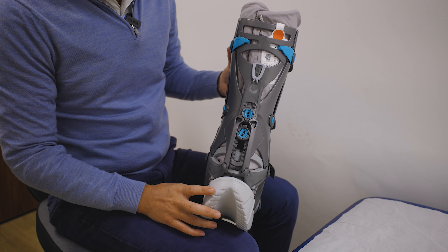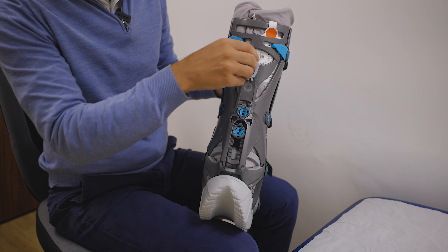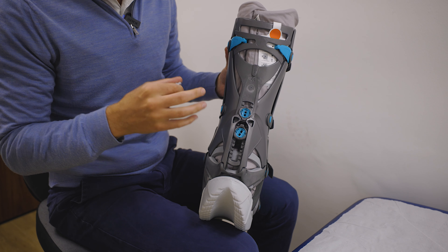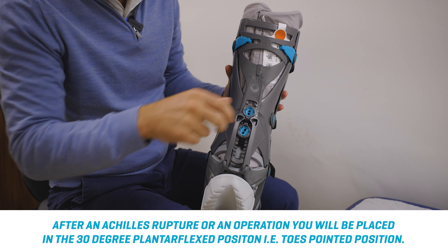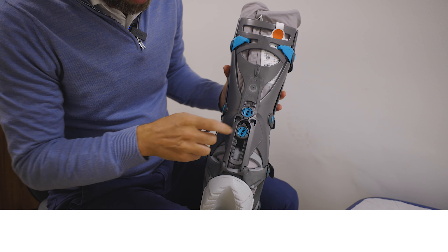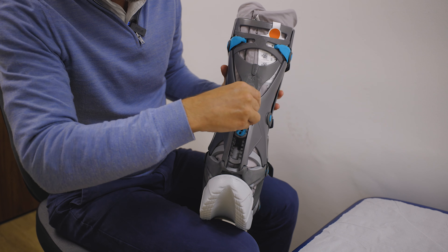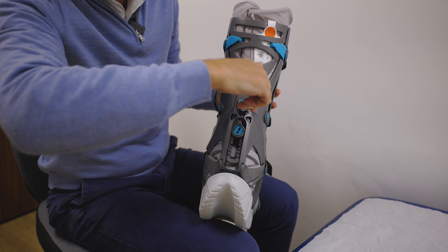The next thing to look at with the boot is the back — it does look quite fancy and complicated, so it is important you know how to use it. First thing to do is just take this clip off. At the beginning of your treatment, you need the boot at that 30 degree plantar flexed position so your toes are down, your Achilles is nice and short and it's healing well. You can see there are two buttons. To make sure you're in that 30 degree position, the top one should be as high as possible — you push it in, twist it, pull it out, and lift it up, twist it and come back out.